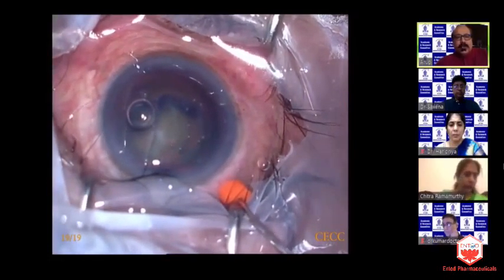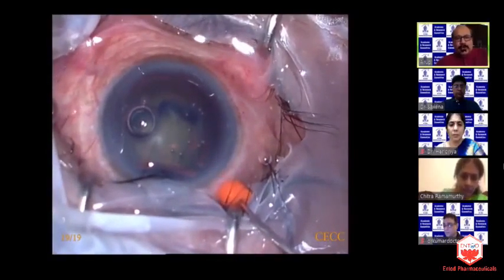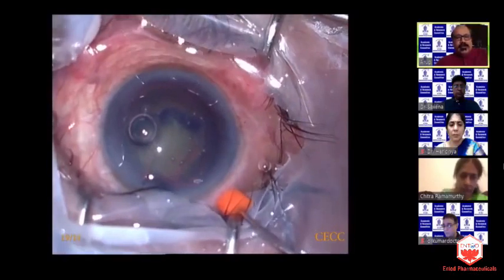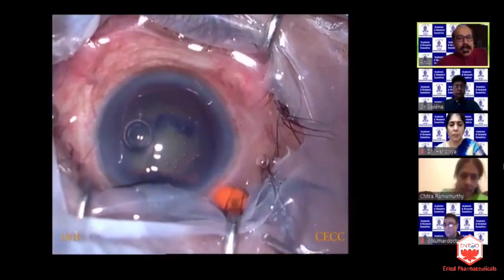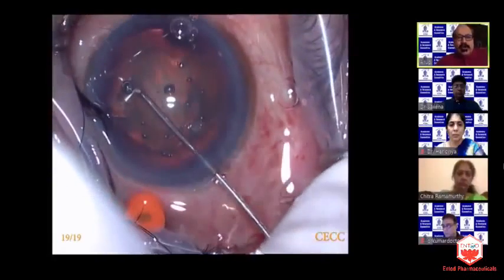So the next step would be cortical cleaving hydrodissection, which anyway makes the pressure go up. So I didn't want to do it before the vitrectomy was performed. So now we need to keep in mind what exactly was the cause for the intraocular pressure going up.